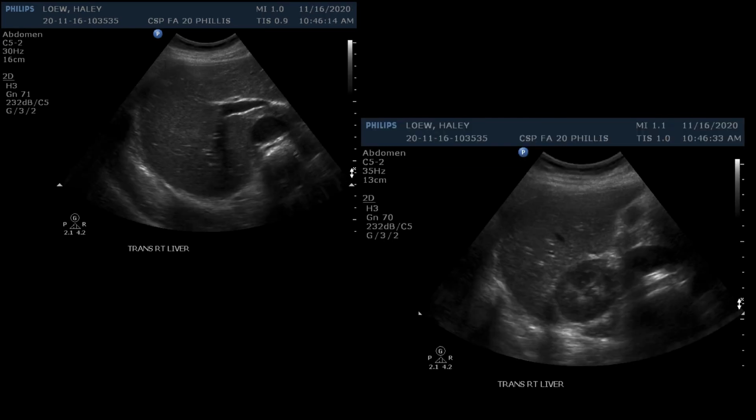The level of the portal vein and inferior tip are imaged next. I think I could have elongated this portal vein more. Portal veins are usually horizontal on the screen. I think different harmonics could have brightened up my far field as well.